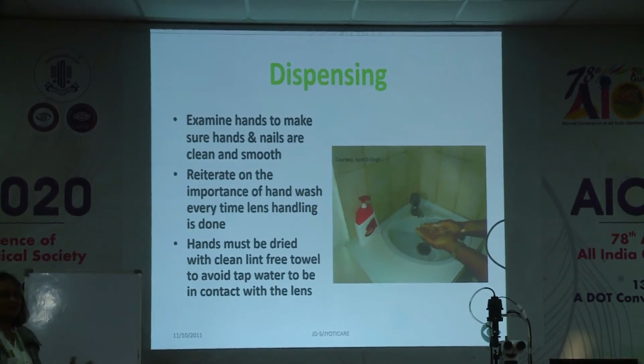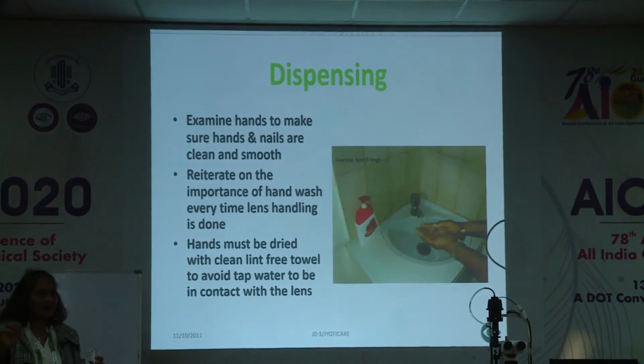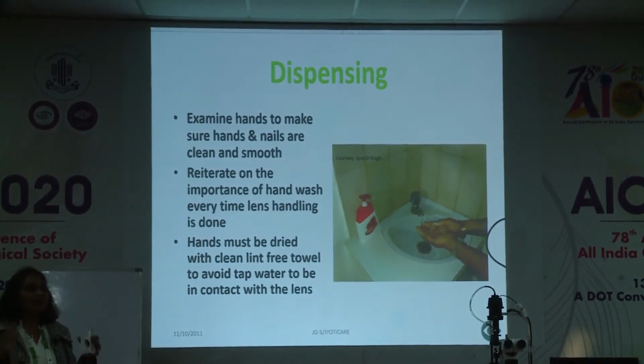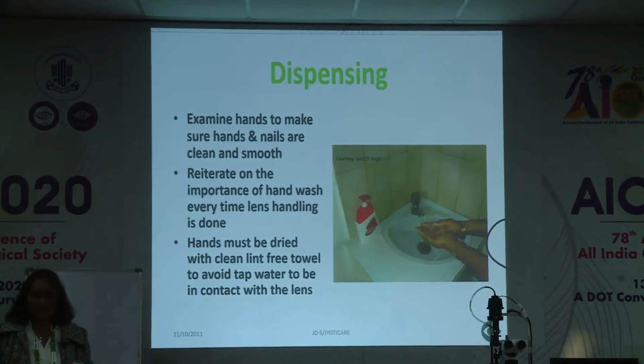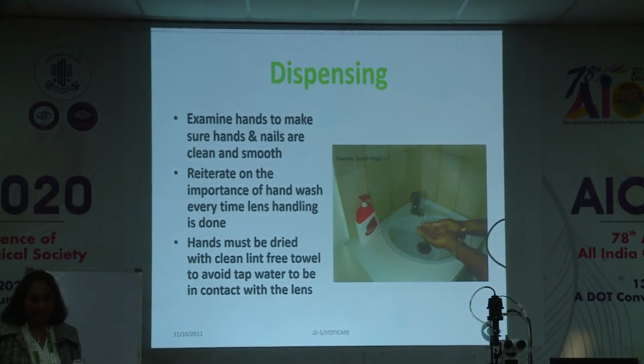What I do when the patient is in my clinic is I examine their hands and make sure that their nails are clean and not dirty, dark, black, and advise the patient to keep their nails clean. That is the first thing you should do. Then I wash my hands completely in front of the patient before even handling their lenses, and then tell the patient that you must wash your hands every time before you handle the lenses, and then make the patient wash his hands in front of me, so that patient realizes the importance of washing hands. As you know, internationally, hand washing is a major important part of healthcare.